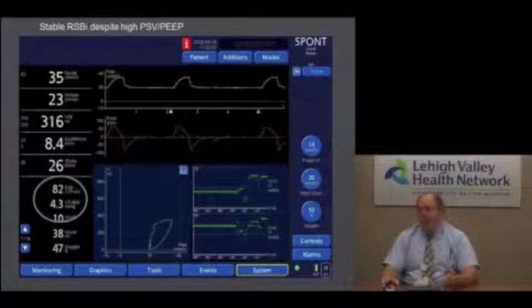10 of pressure support to 16 of pressure support is moderate, and when you go above 16 of pressure support, that's considered pretty high. We've had patients on 30 of pressure support, 20 of pressure support, so it depends on the situation, but typically you have the mild, the moderate, and the high levels of pressure support criteria. Typically, patients on pressure support 20 are not ready to be ventilator liberated, but that may be what's needed in order to get the patient synchronized with the ventilator and diminish work of breathing.